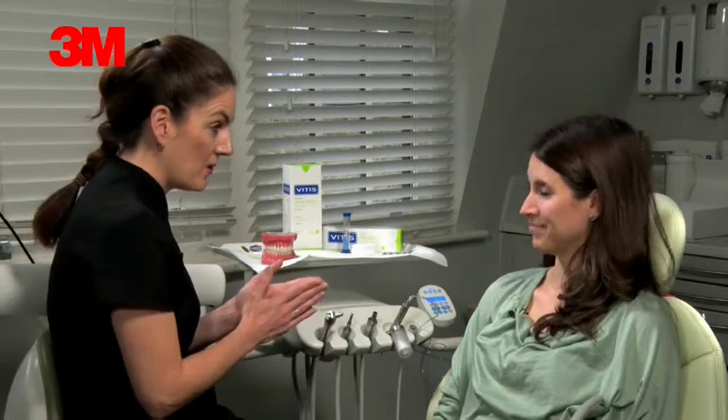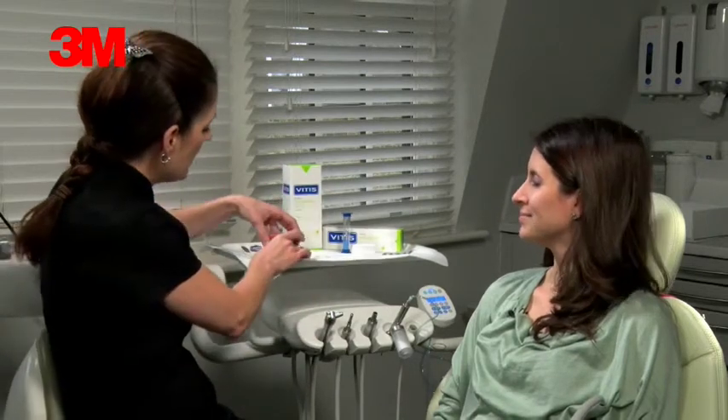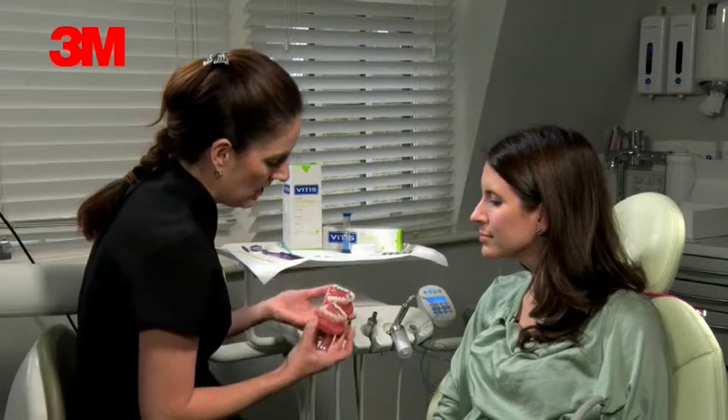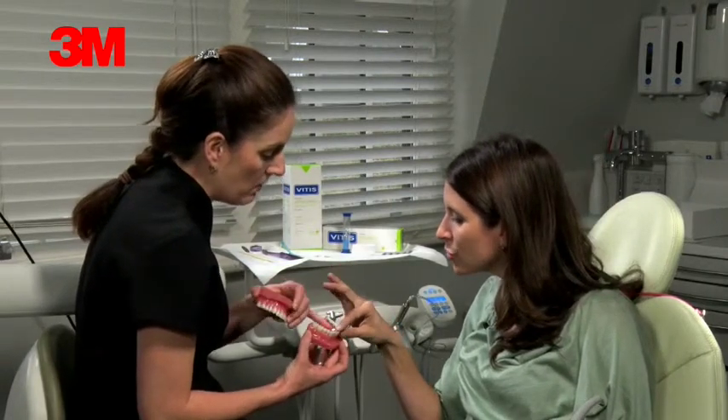Hi, so you've just had your brace put on today. I'm just going to go through some instructions on how to look after it and what to expect. This is what the brace looks like on the inside. So you've just got the lower put on today.